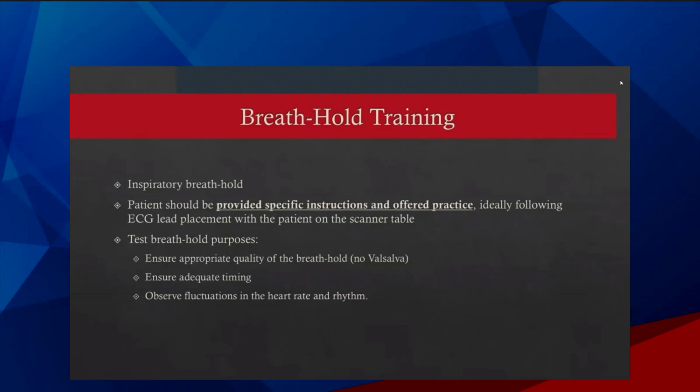You also want to make sure you observe any changes or fluctuations in the heart rate and rhythm, so that you're able to better gauge how the scan is being done.